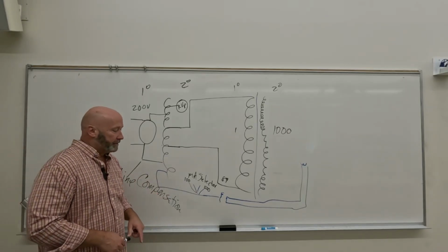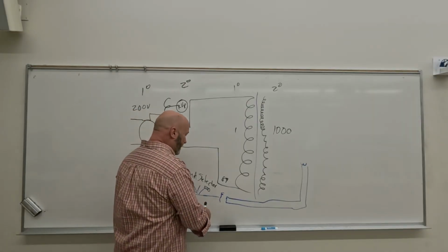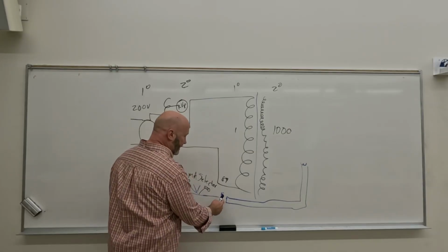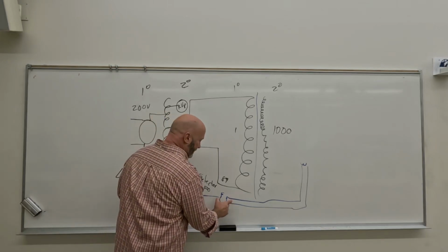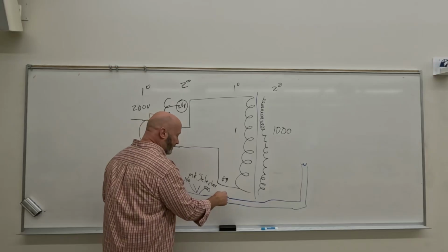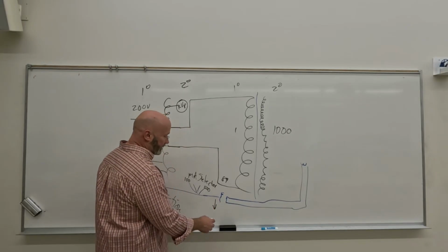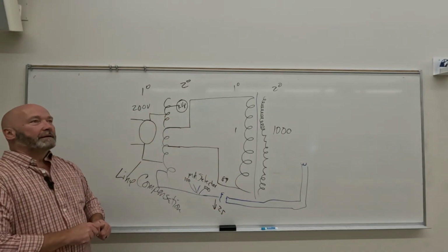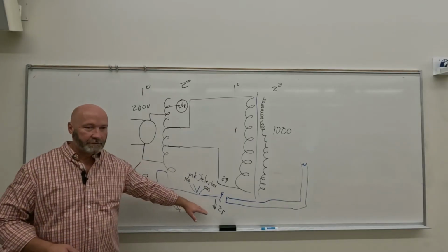So that's your mA selector. We send, through a separate circuit, electricity through the mA selector, and then we select our specific mA, and it's got to compensate for this thing, because as we send our electricity through this, what's going to happen to our voltage if we have more turns on the primary side than the secondary side? It drops, right. So your voltage is going to drop to like 25. I'm sorry, it's not kVp, that's voltage. What would be the significance? Why would we want such low voltage?